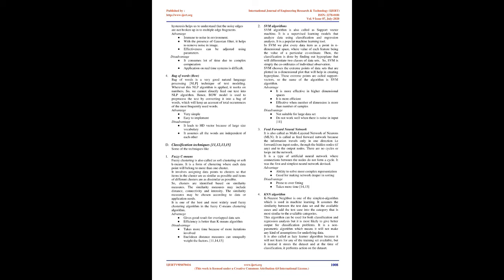3. Canny edge detection. It is an operator that uses a multi-stage algorithm that detects a wide range of edges in images. It takes a grayscale image as input and produces an image as output which shows the positions of the tracked intensity discontinuities. The image is smoothed by Gaussian convolution at first, and then a simple 2D first derivative operator is applied to the smoothed image, which highlights the regions of the image with high first spatial derivatives. Edges give rise to ridges in the gradient magnitude image. The algorithm then tracks along the top of those ridges and sets all the pixels to 0 that were not on the ridge top, giving a thin line in the output. This process is called non-maximal suppression.